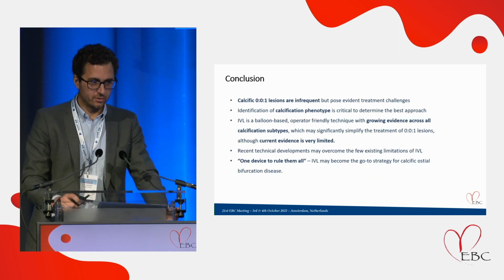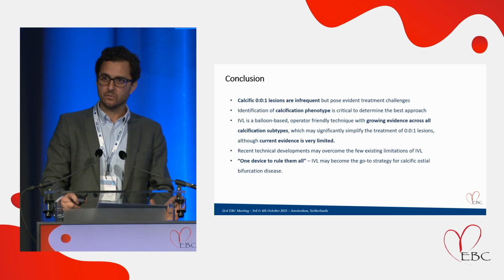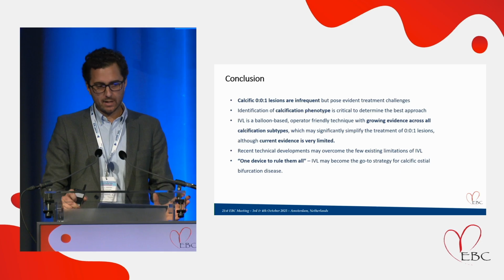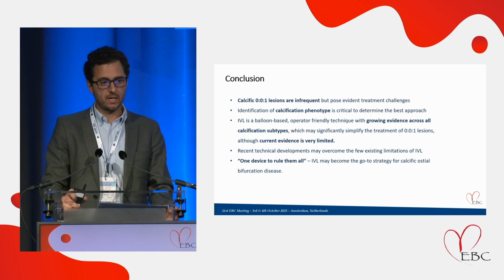As a conclusion, calcific 0.0.1 lesions are infrequent, but are absolutely a challenge for operators. Identification of the phenotype of calcification is absolutely critical to define the best approach. Otherwise, we don't know what we're doing. IVL, I truly believe, is a balloon-based, operator-friendly technique, with growing evidence across all calcification subtypes, which may simplify the procedure.